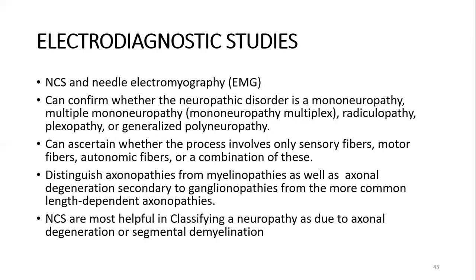So I'm going to discuss something about electrodiagnostic studies in neurology. These are the nerve conduction studies and electromyography, and that's what I want to talk more about today: nerve conduction studies, specifically in correlation with peripheral neuropathies, peripheral nerve diseases. Nerve conduction studies are most helpful in classifying a neuropathy pattern as due to axonopathy, axonal degeneration, or a segmental or demyelinating disorder.